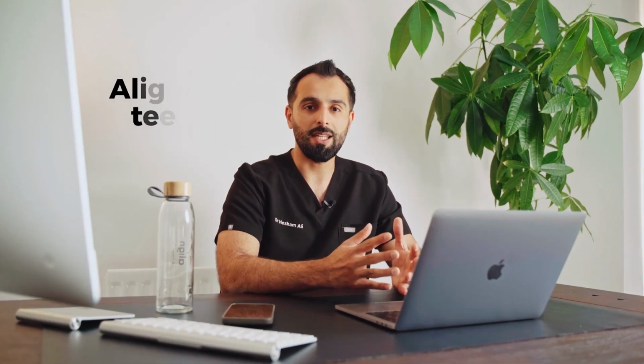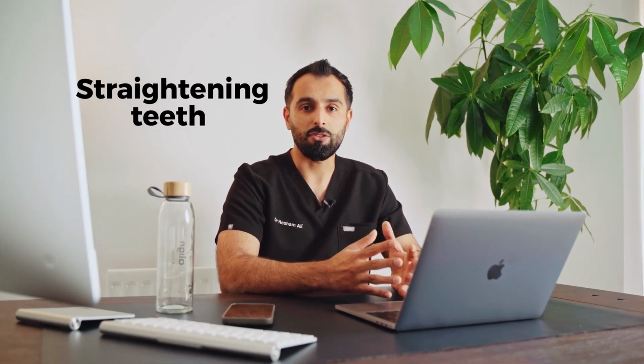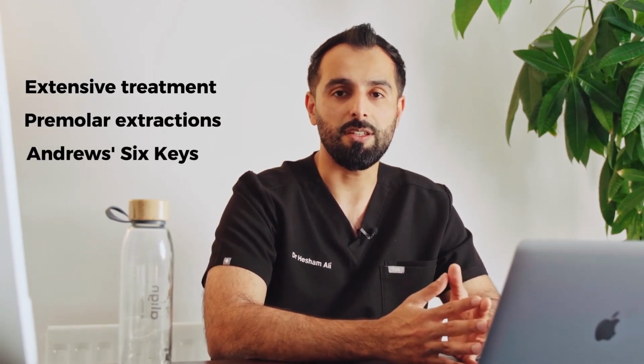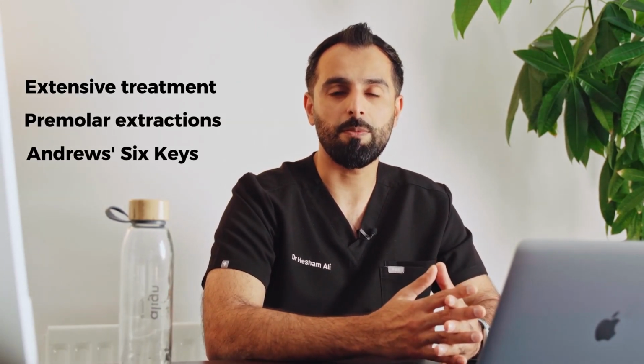So this discussion really is focused on aligning teeth, straightening them. It's not really focused on the cases where we're trying to achieve a class 1 outcome and we're trying to fully camouflage. Not all patients want to have extensive treatment or want to have premolar extractions and want to achieve Andrews' 6 keys. So this really is a discussion based around patients who simply want to have aligned teeth and how we submit their prescription for them.